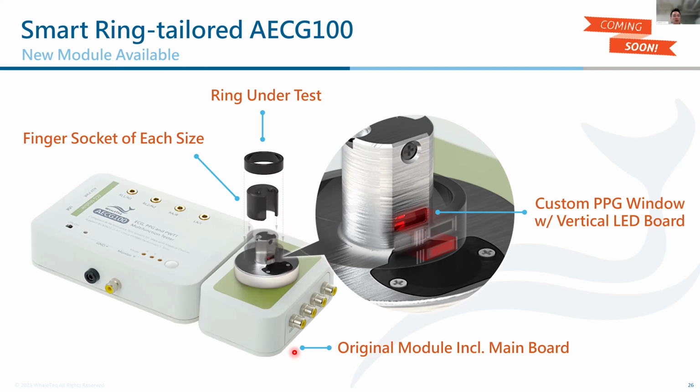So this is the exploded view of it. If you have a closer look, we have an LED and a PD. The PD is ready to detect the LED sampling frequency of the smart ring, and then we use the same LED sampling frequency to shoot back for sketching the right PPG waveform on the ring's PD and also the signal processing hardware.